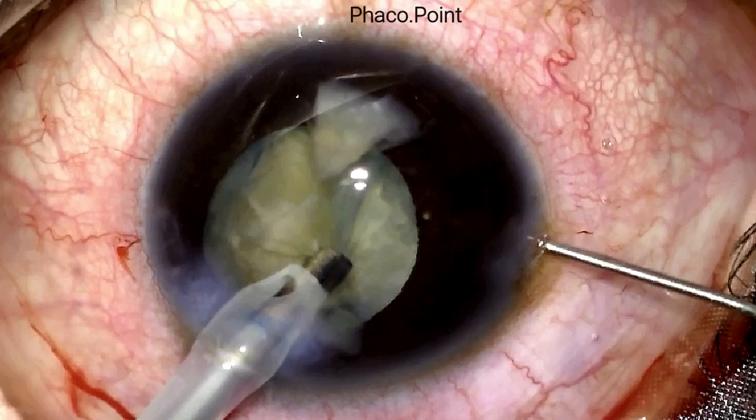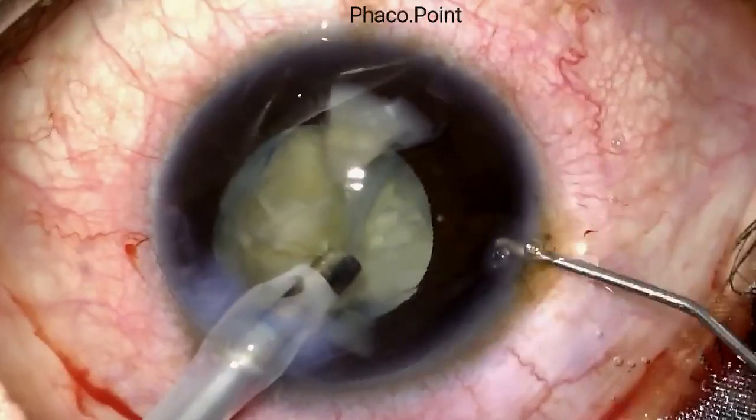We now get to one of the most important steps when performing phacoemulsification in an eye with a compromised anterior capsule: the viscofluid exchange. It is extremely important to remember that whenever you are withdrawing the irrigation source — whether the phaco probe or the irrigation-aspiration handpiece — out of the eye, there is always a chance of shallowing of the anterior chamber. If the chamber shallows, the tear in the anterior capsule could extend to the equator and compromise the posterior capsule. To avoid this, always perform a viscofluid exchange prior to removing the irrigation source from the eye.